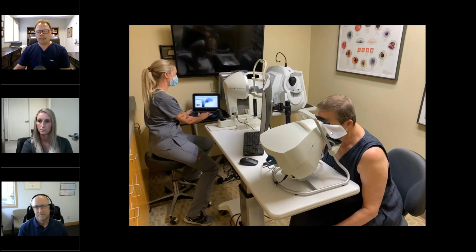Right. If I want it, I'll just screenshot it and save it as a JPEG or a PDF, and they can scan it from there. In fact, we don't even have color printers in our clinic simply because we don't want to deal with that. I guess for the OCT we do. But I like just having it in the computer. It's there anytime I want to see it. I flip on the machine, a minute later it's booted up, and I look on the computer and I can pull up those same maps. Right.